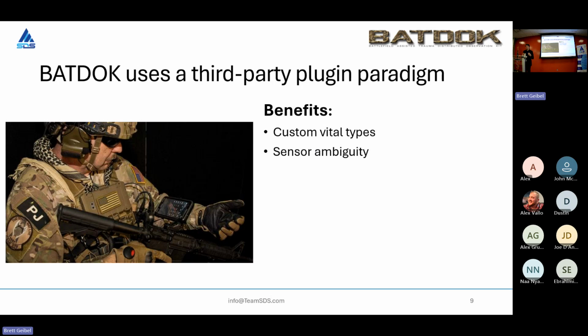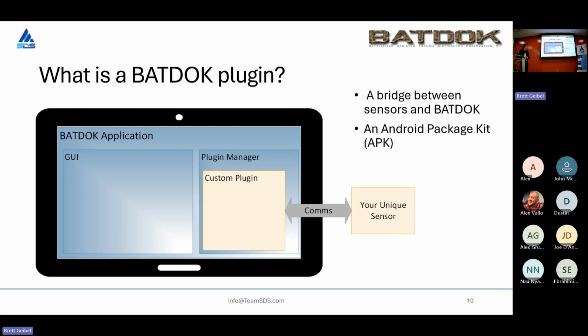Now, it does require a little bit more expertise and engineering to get that plugin functional, but it does allow a much broader spectrum of sensors to be compatible with BATDOK. Essentially, almost any sensor you could think of or imagine could probably be integrated with BATDOK in some way, which I think is a great advantage.